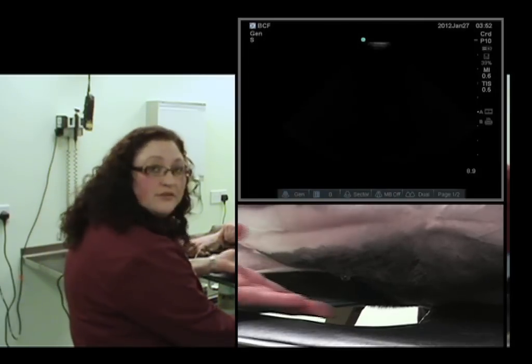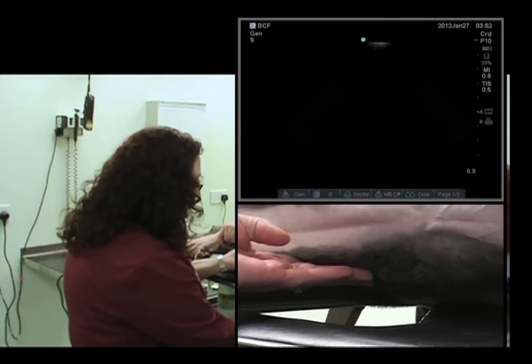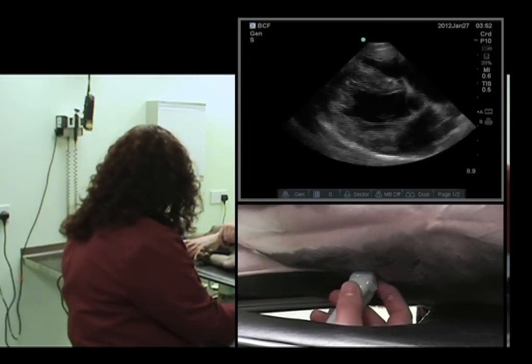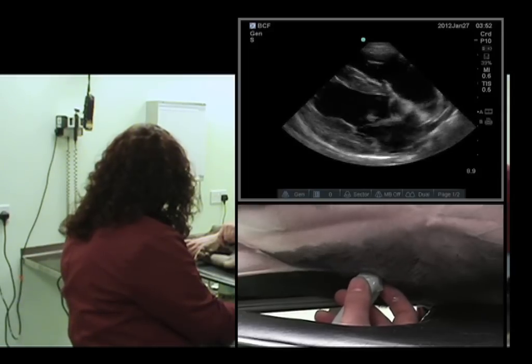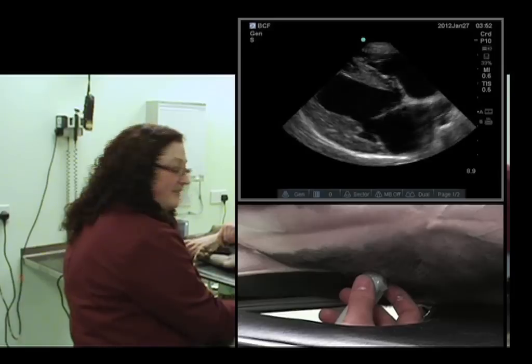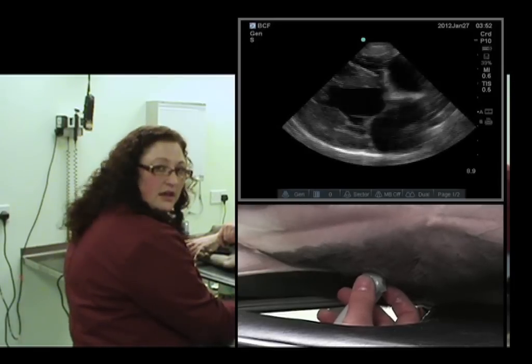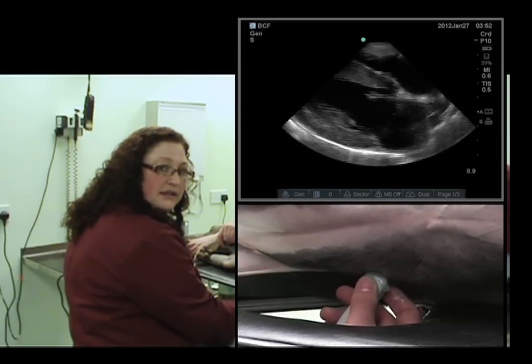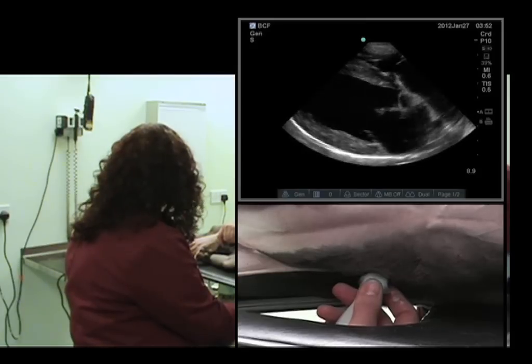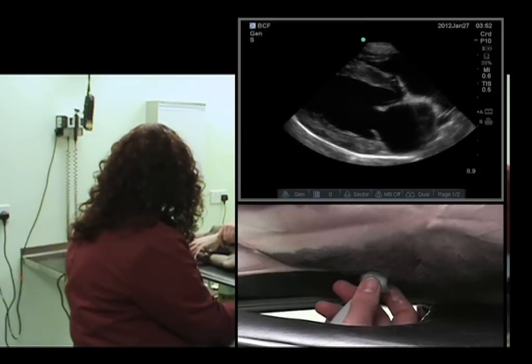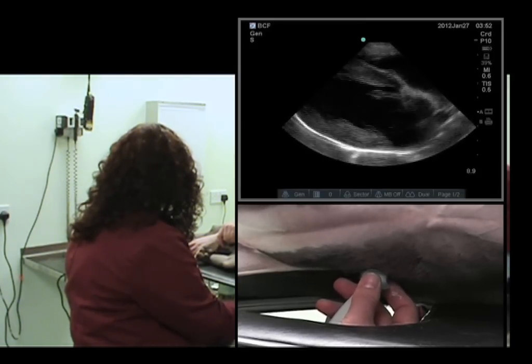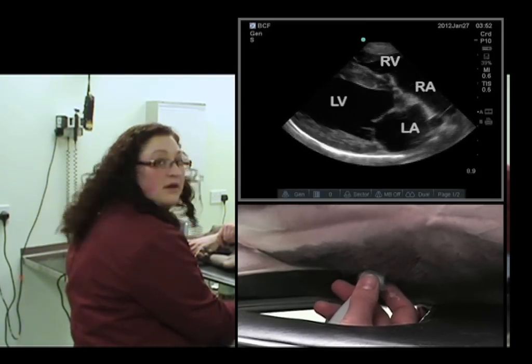I'll feel for the apex beat and I've applied a bit more ultrasound gel. We almost have our long axis view — we'll just need to make a slight adjustment. We'll rotate slightly anti-clockwise, thumb to bum, and there we have a nice view.